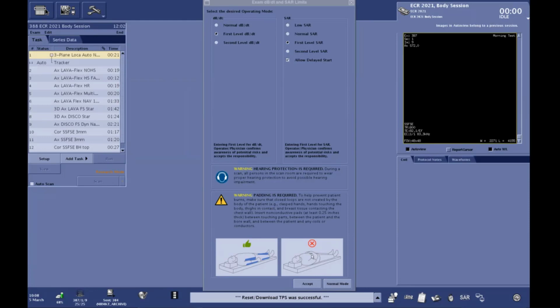And I think that now we have Jeremy on the other side of the scanning room, ready to explain to you all about body imaging. Yes, thank you, Bastien, for all of those information and explanations.